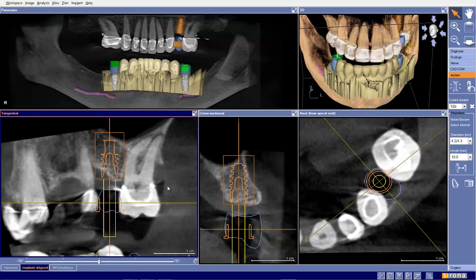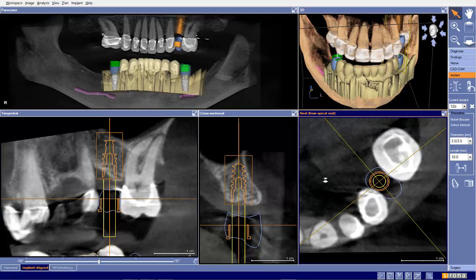The other concern with this particular site is we will not get the sleeve in here. To get a sleeve in there, we'd have to go to a 3.5 millimeter implant, and even then, it's still very tight. My question becomes twofold on this particular implant. One is restorability. How thin is this going to be? By the time we get our abutment in there, ceramic restoration, are we really going to have the space to be able to seat this? Or are we going to have to really do some plasty on the distal of number 11 and on the mesial of 14 there.